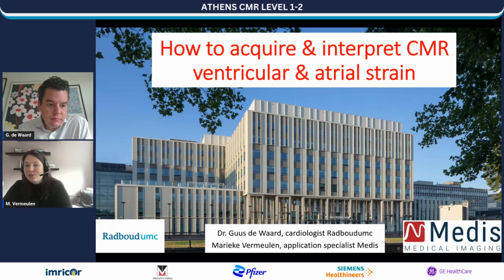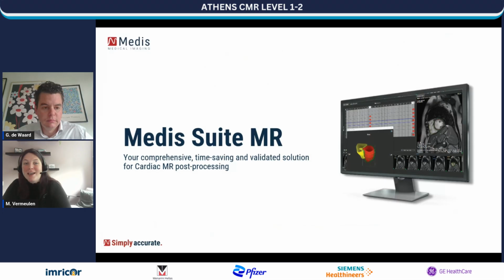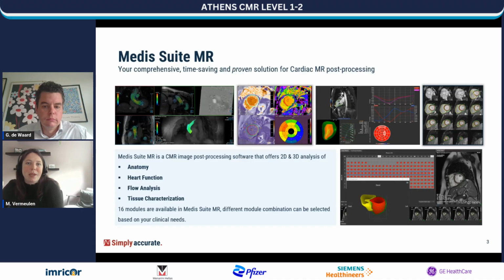Yeah, thank you, Guus, for the introduction. So to kick off this presentation, I want to give a brief introduction into Medis Medical Imaging. Medis Medical Imaging is a post-processing company where we post-process cardiovascular images, and we do that multimodality. But for today, we want to focus on our CMR product, which is a comprehensive, time-saving, and validated solution for cardiac MR post-processing.